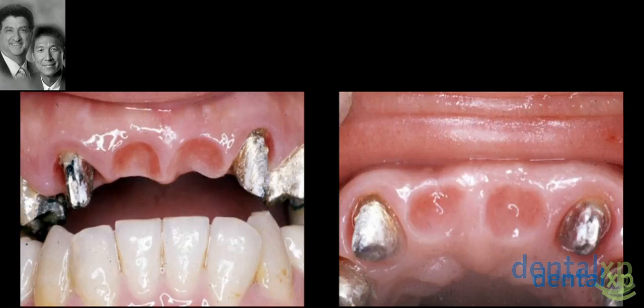So, can we repair the problem? What's the most obvious thing that we've been doing for years? Just do pontics. Right, do ovate pontics. And certainly the pioneer work by David Garber, Ed Rosenberg, Lenny Abrams, and all the incredible work done at the University of Pennsylvania. David is going to go through this in further detail with some of the newer things that he's doing, including submerging roots under here. David and Maurice are going to go through that.